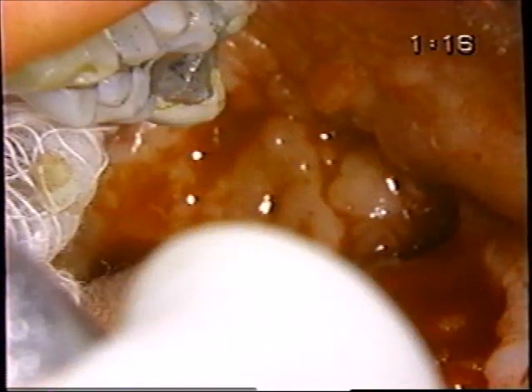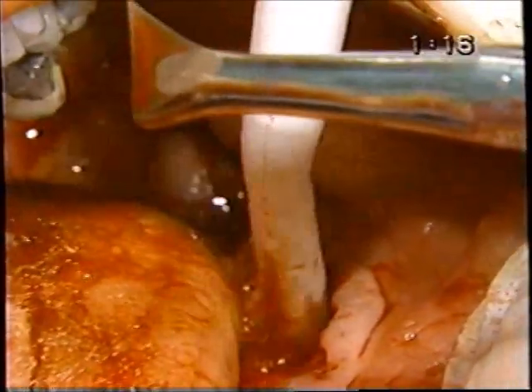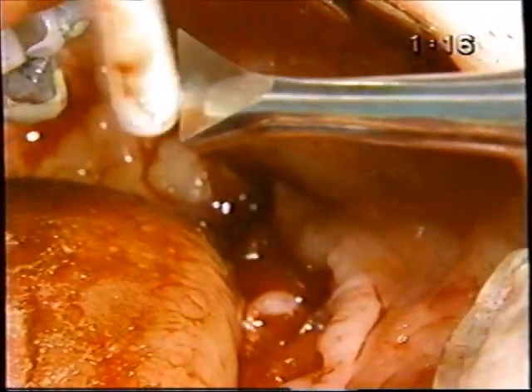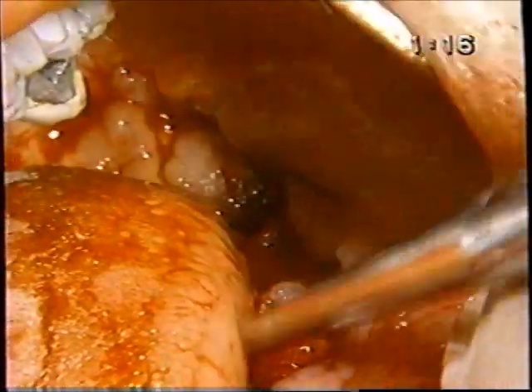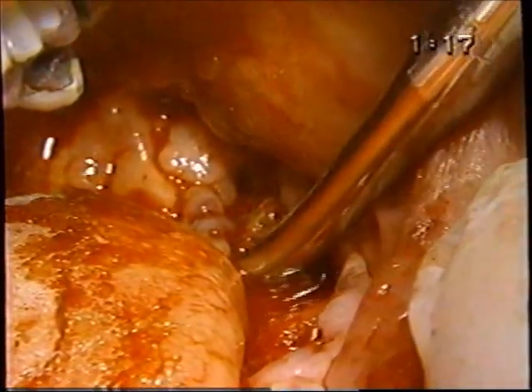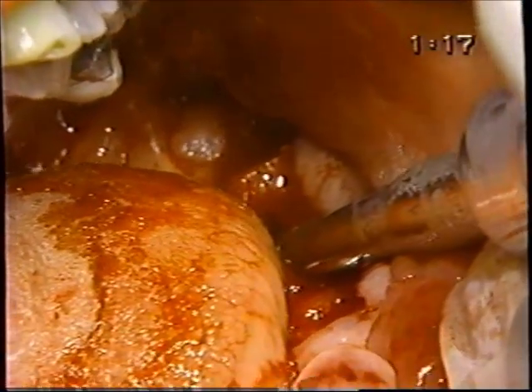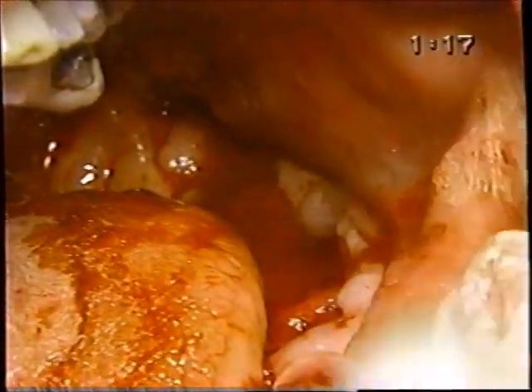Now this is the last one. It's a wisdom tooth that's in pretty bad shape back there. Really nothing to grab onto. We could flap it more, and we may end up having to do that, but for the time being, I'm going to use a crier, this one, suction on the top of it if you would. There we go, clean it up a little bit. We're going to try it from where that second molar was and see if we can't engage that loose tooth. Let's see what came out.